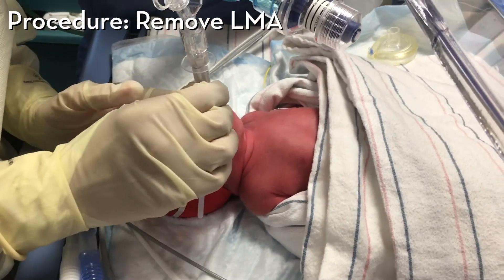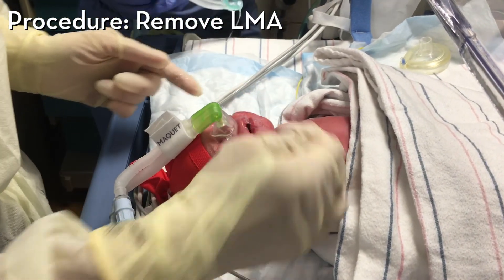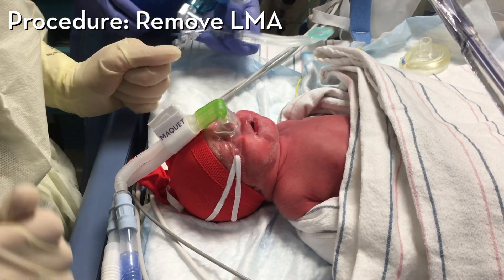The LMA is removed and the CPAP is placed back on the baby.